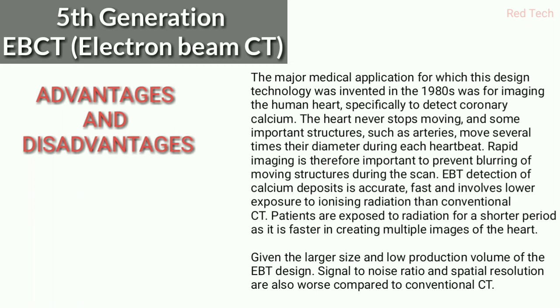Nowadays we see that in spiral CT we can find out the calcium scoring, but in the 1980s this machine was invented to detect coronary calcium in the heart.